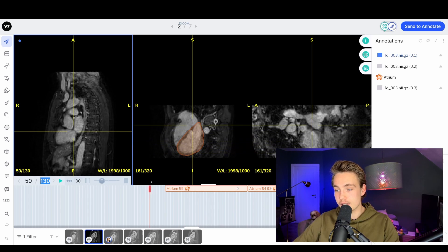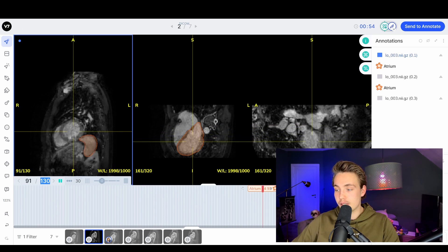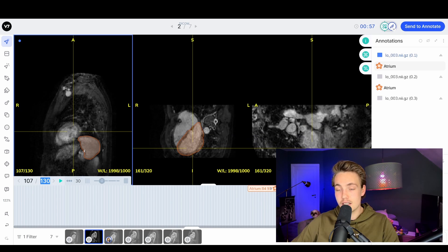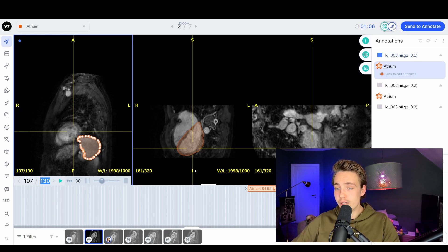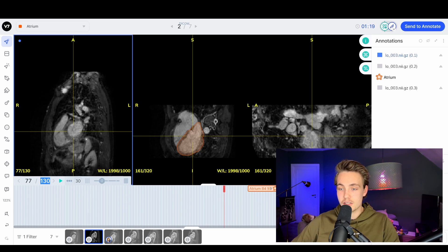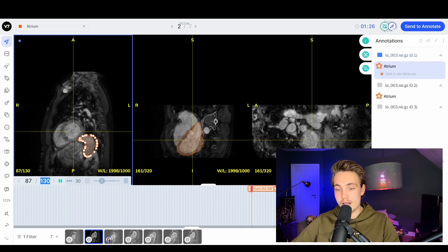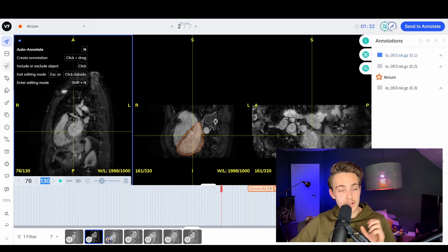I'm just going to show how we can do labeling of these things. I'll delete this one here. At the end we can see we're annotating this atrium - this is basically an atrium inside of a heart. We can see the polygon tool is used for annotating this part. If we look at the start, before we get to this annotation, we can see it starts around here. There's nothing here initially, but then when I start to play it in the next frames, we start to see the atrium appear. We can start to annotate from here instead of waiting until this frame. I just want to show you how we can also utilize the annotation tools for the medical images.